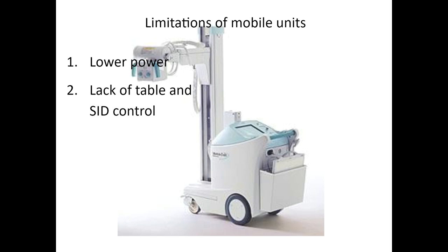A few of you said you've done or at least seen a KUB portable abdomen. Easy? No. We have to repeat a lot. So you use the grid for that exam. You use a grid for two reasons: a thick part, but also there's less angling on the tube, so you don't have to worry as much about grid cutoff. But they're hard. How do you know the patient's in the middle? You stab your patient right through the middle, then you take out your cassette, see if it's in the middle, and then try to do it again. You just feel on one side and feel on the other side. It's like putting on a tablecloth, right? I need a little bit more here. It's not that easy to do, right?